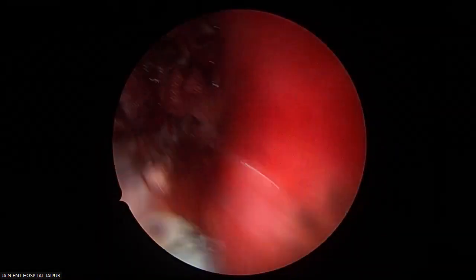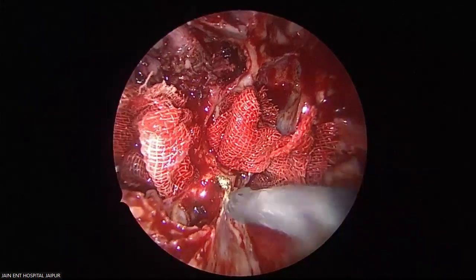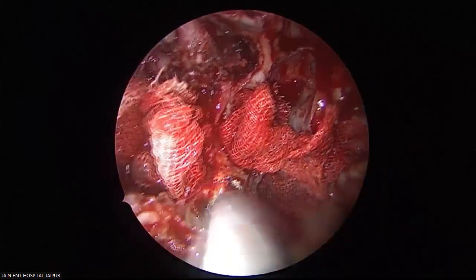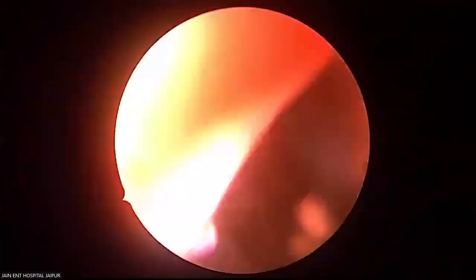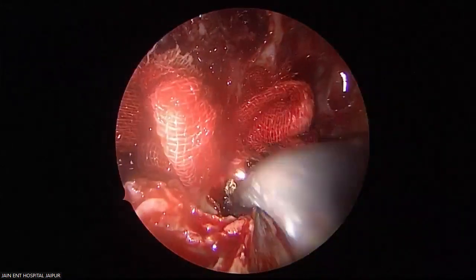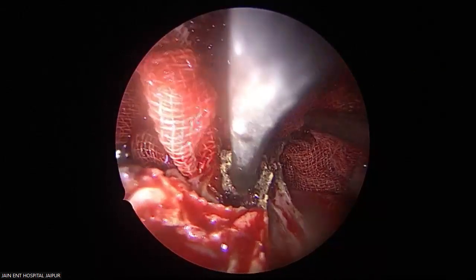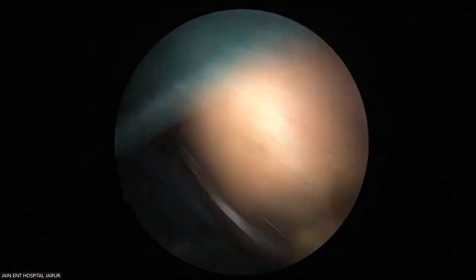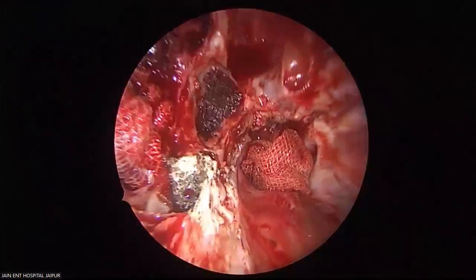The final touch going on. See the bleeding from the bony surface, you know, or you could use a diamond drill, like we use in otology. See now all surfaces.